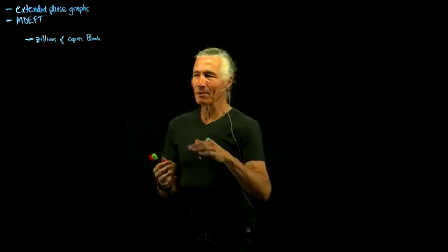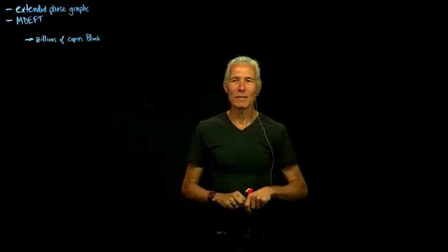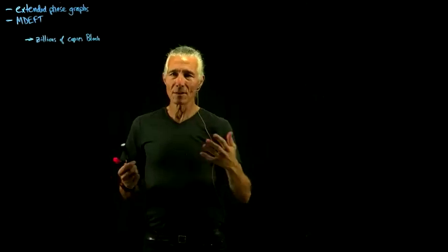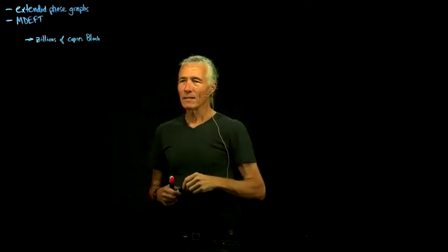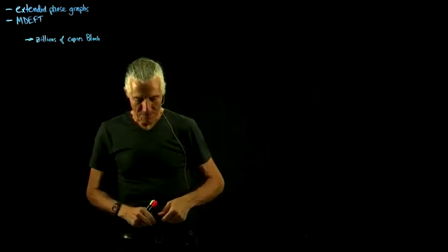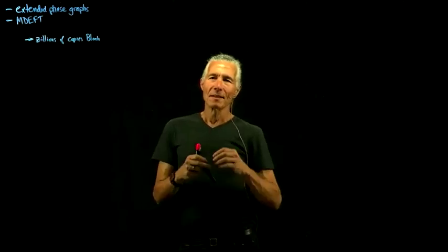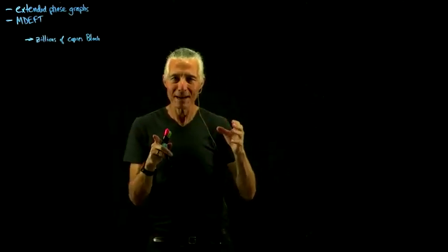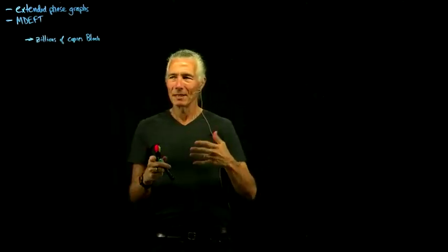And what is an echo? An echo is when all those Bloch equations come back into alignment. But you can see that doing that is kind of tedious. When people do simulations, they'll make like 1,000 copies of the Bloch equation and then see what's going on, and it's kind of difficult to visualize it all in one place. And so that's what the extended phase graphs are basically trying to do, to make this spread in the phase back into some simple 2D diagram that we can understand as a primate looking out at the world of this simple 2D graph.